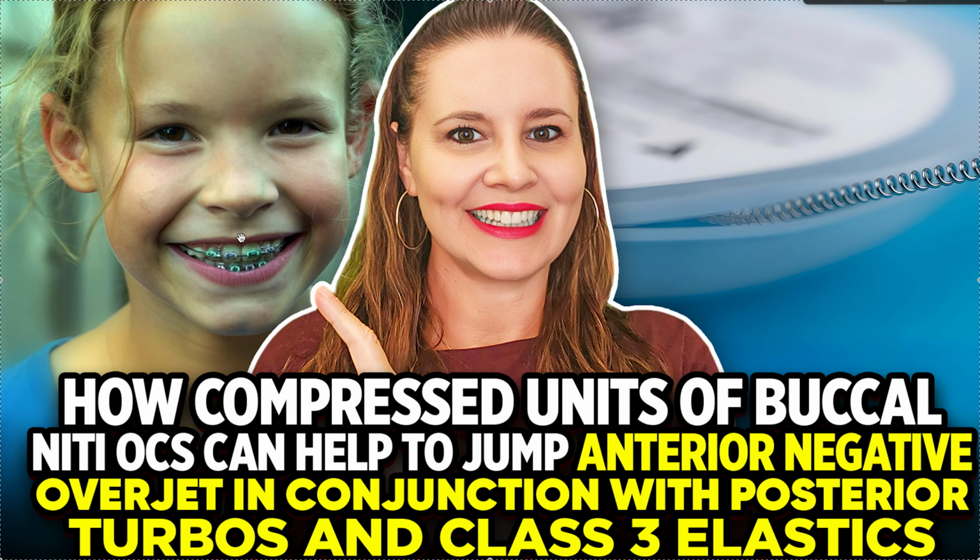So one of the tricks I like to use in a phase 1 situation like this is, you see how there's long spans on the top. If you've gone through my phase 1 Straightwire course for braces, in the first phase we talk about 2x4s, and then eventually we work our way up to a large wire, which is connected to the back. Initially, we're in a sectional wire that's cinched, right? Now we're in a big wire.